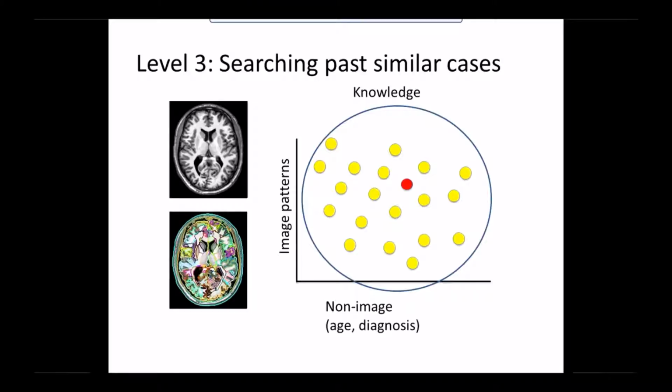So we're annotating those with the clinical record, and that forms training data that we can then do machine learning on. Once we have a brain and we've structurized it into quantitative matrices, then we can search against past similar cases. So we're building a tool that we're putting as a client down in the radiological workflow area. We currently have 4 radiologists that are trying to use this now.